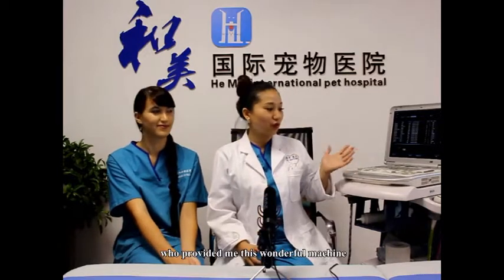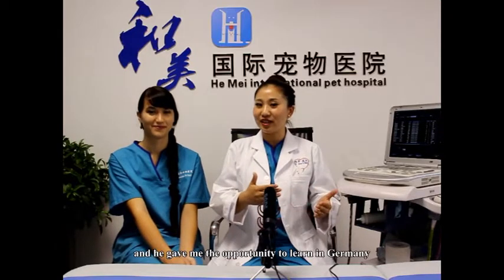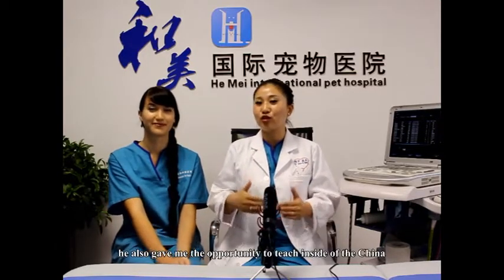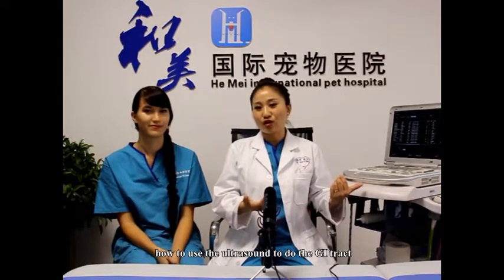He provides this wonderful machine, and he gave me the opportunity to learn in Germany, and also the opportunity to teach inside of China, not only to Chinese-speaking students, but also to English-speaking interns. So I'm very happy, and very grateful to have this great opportunity to show you how to use ultrasound to examine the GI tract.